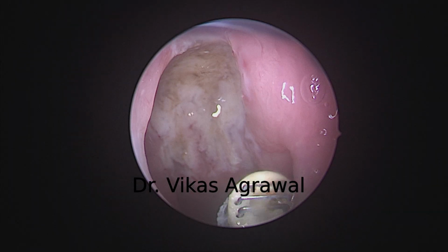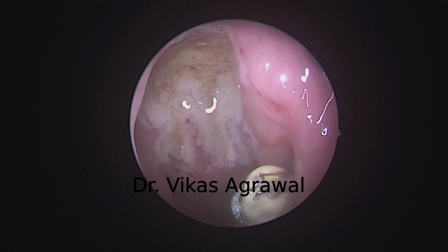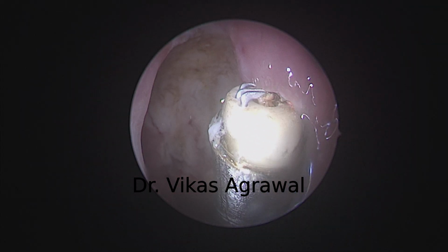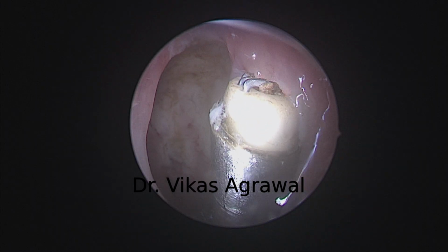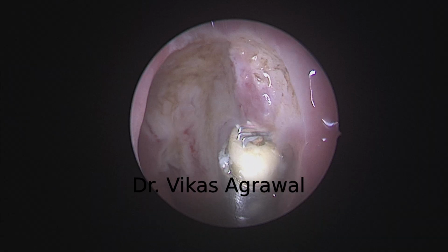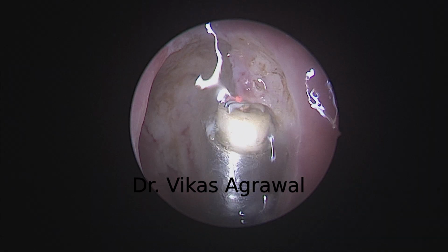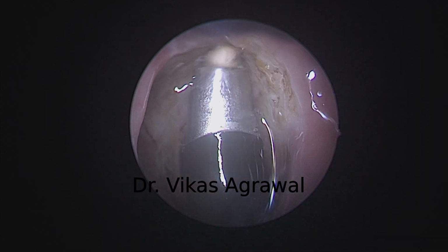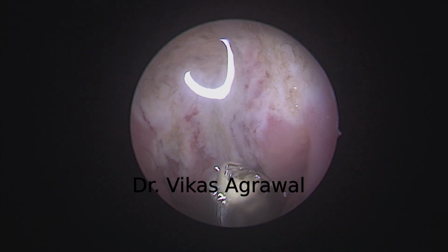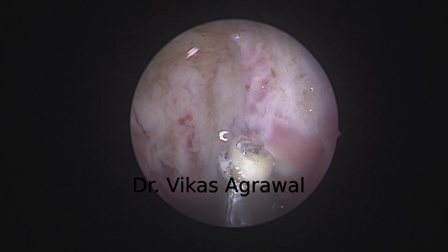This is the lateral boundary. Lateral boundary anteriorly is the torus tubarius. Can you see this is the torus tubarius? And we still have some lymphoid tissue on the torus tubarius, which I am removing. This is the lateral boundary of the adenoids in the anterior aspect. This is the eustachian tube, and this is the torus tubarius.